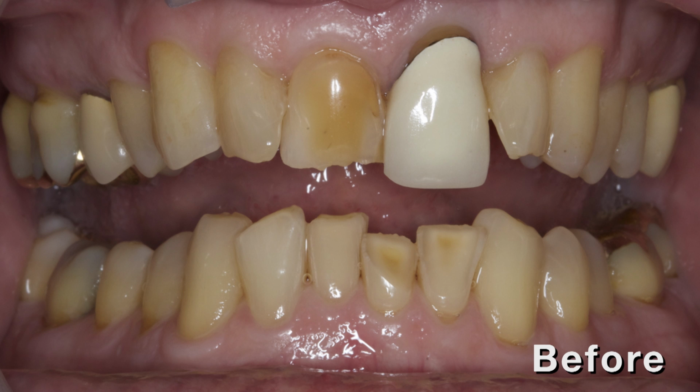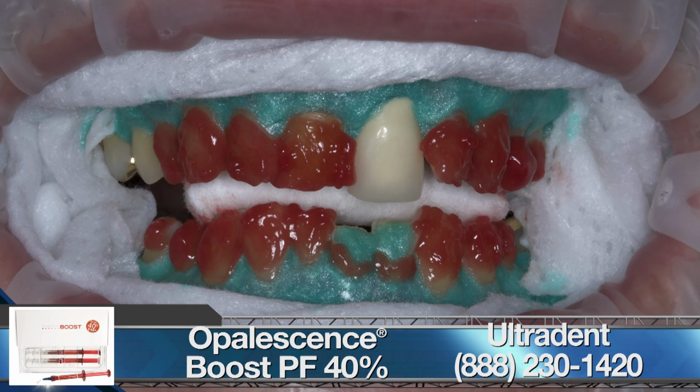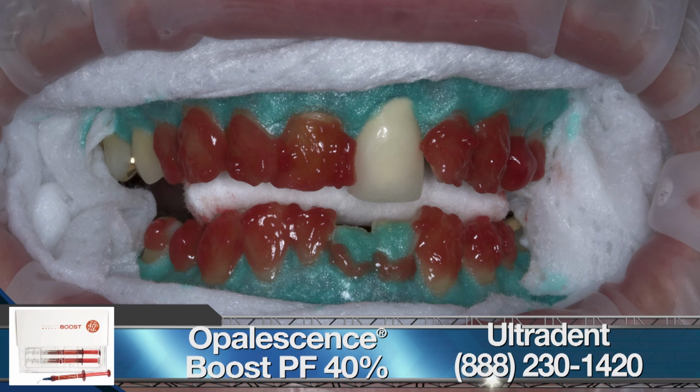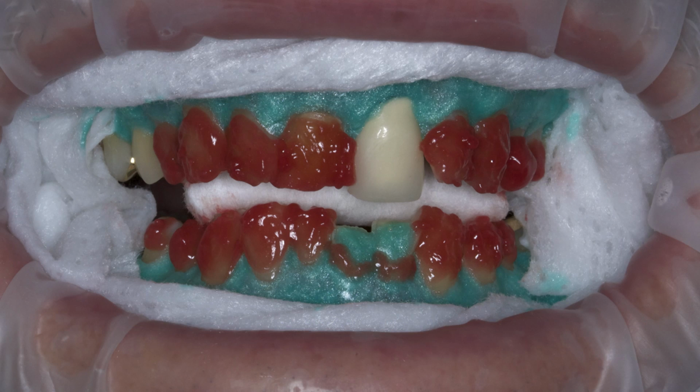Before any operative procedures begin, we elect to whiten the patient's teeth in hopes of achieving a shade A2, so we can match the new restorations to the rest of the natural dentition. We use the Boost in-office whitening kit by Ultradent, where it is a 40% concentration of hydrogen peroxide gel that is applied to the teeth for 20-minute intervals. For our patient, we went through 3 cycles for a total application time of an hour.